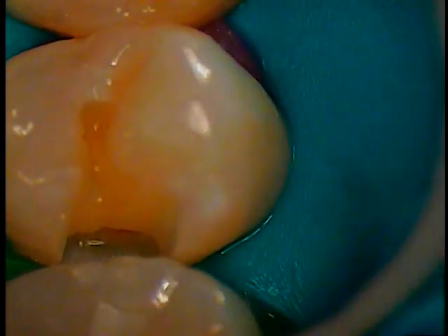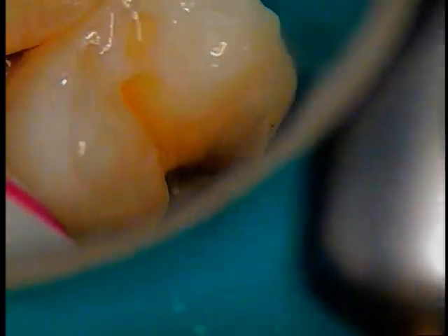See how it's tunneling underneath now, right? A little bit. So you get in there, clean that out. Make sure it's up against the roof underneath. Air in the mirror. A little more water down in there. And I'm going to go laterally. And that should do that. And now I'm going to take the fine diamond and go one more time against the axial wall.